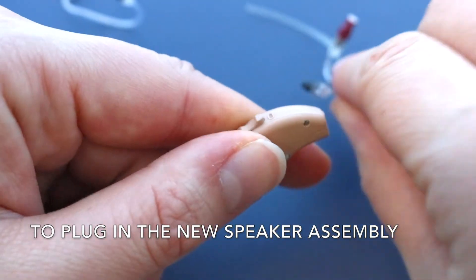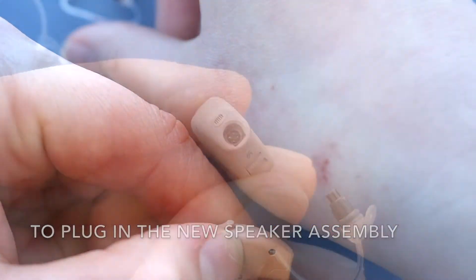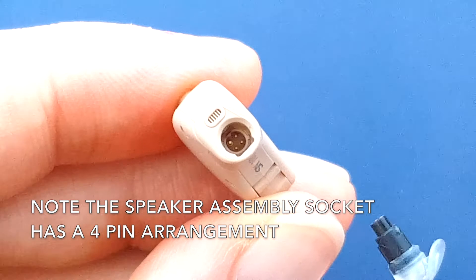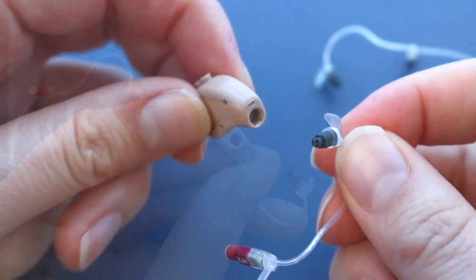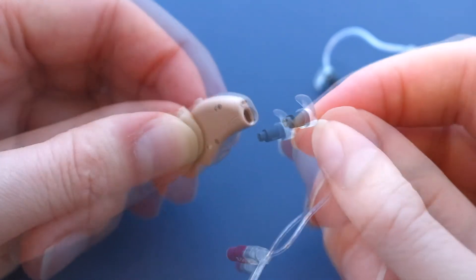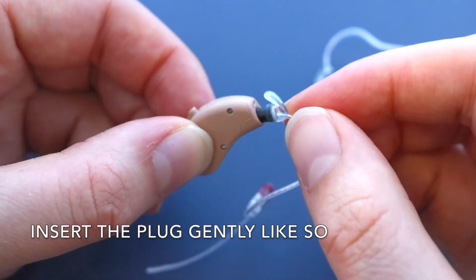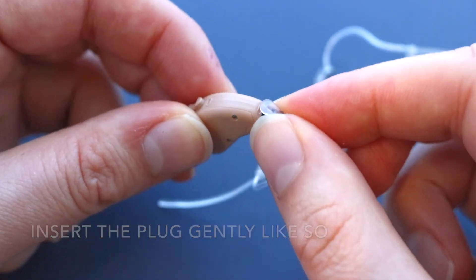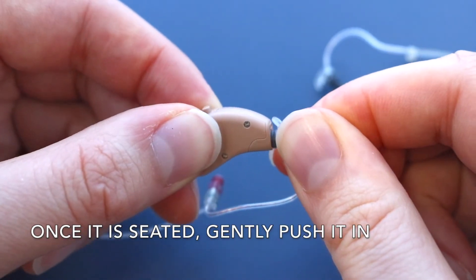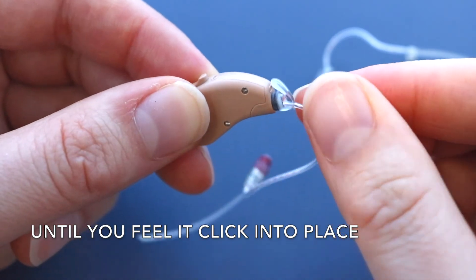To plug in the new speaker assembly, note the speaker assembly socket has a four-pin arrangement. Insert the plug gently like so. Once it is seated, gently push it in until you feel it click into place.